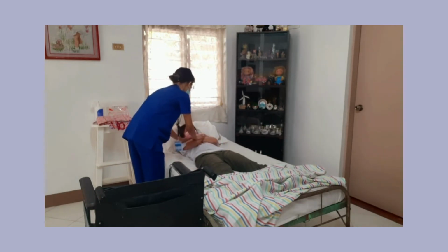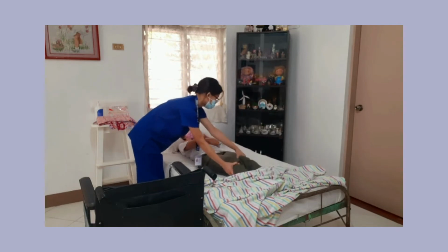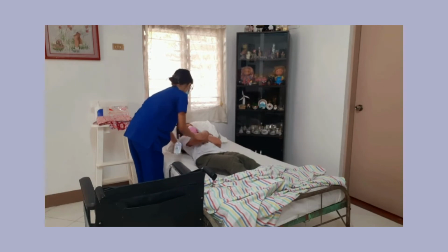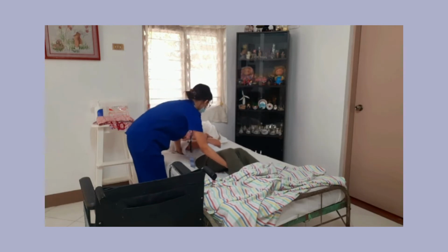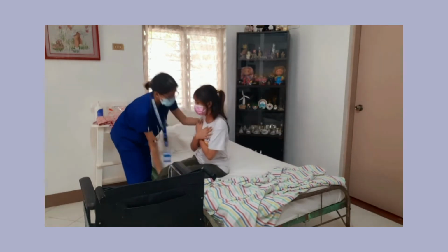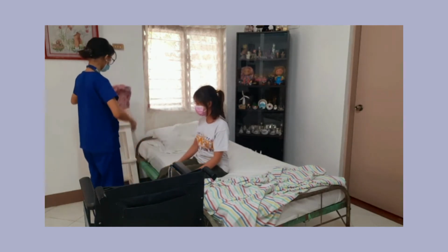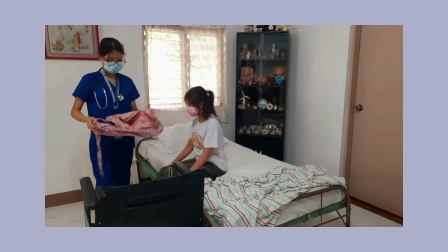Put your hands on your chest, and now I'll be putting my left hand under your shoulder and my right hand under your knees. On the count of 3, I would like you to help me, and I'll be putting you in a sitting position. 1, 2, 3. Now, ma'am, can you please move forward on the edge of the bed?